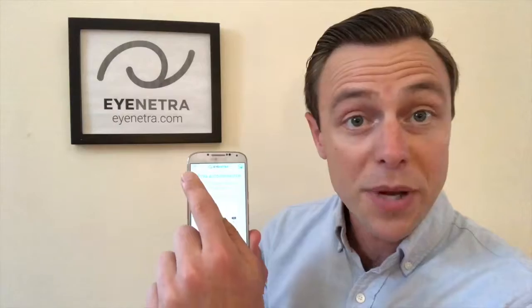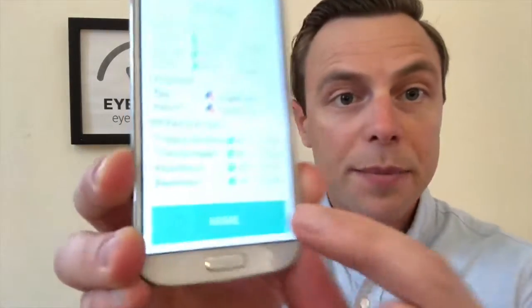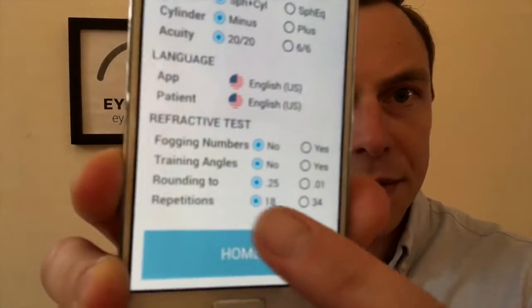One of the recent updates to the Netra autorefractor contains the new 34-repetition mode. By selecting 34 repetitions instead of the standard 18, the patient now has more measurements to perform during the test. The added measurements translate into an increase in accuracy, making the measurements that much more reliable. To engage the 34-repetition mode, simply open up the Netra app, select the drop-down menu in the upper left-hand corner, select App Settings from the menu, and then towards the bottom you can change the repetitions from 18 to 34.